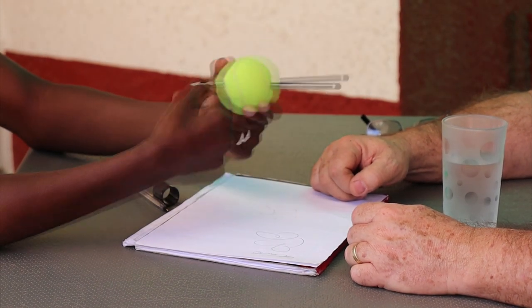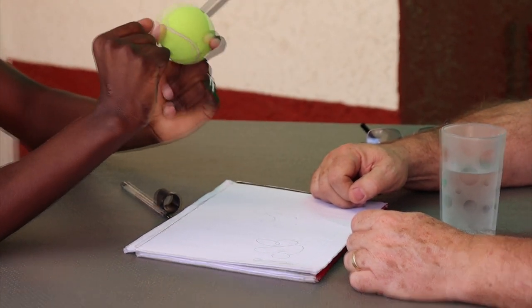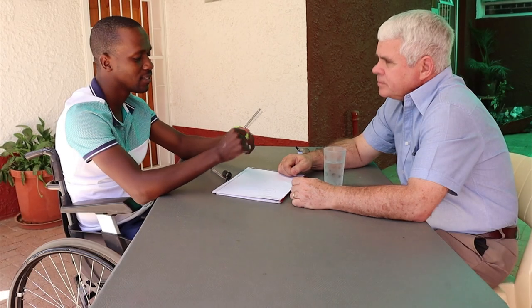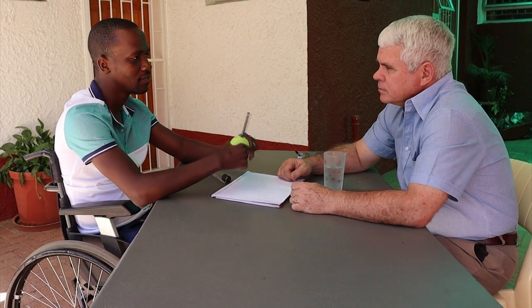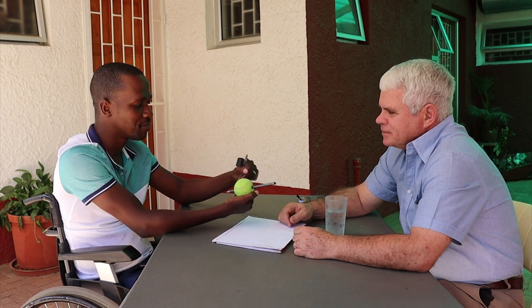Even people who have a problem with fine hand control with their fingers — maybe arthritis or whatever — can benefit. So these are still pen handles, or grips. That's what we call them. A tennis ball and an irrigation pipe — very simple.